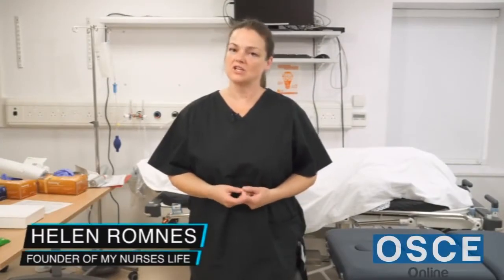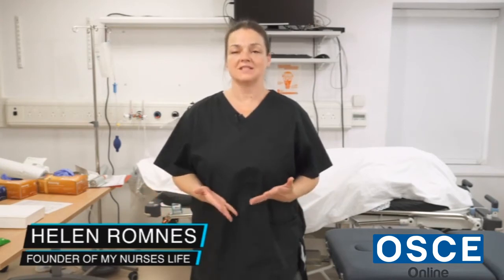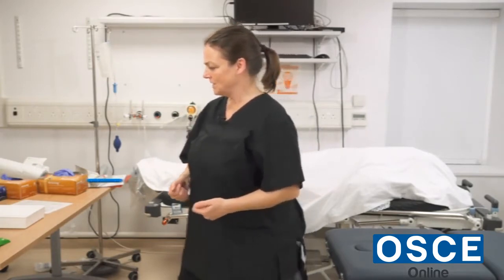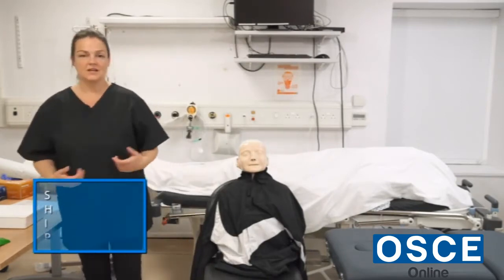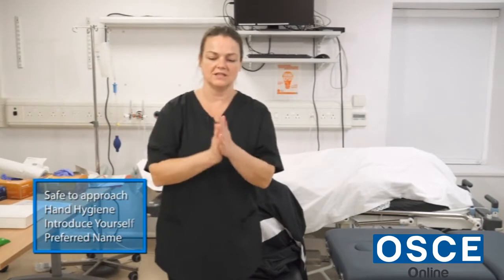I'm going to go through the inhaled medication administration scenario. It's basically always the same medication, it's salbutamol, and we're using a spacer device, which is a more effective way to take the inhaler rather than the inhaled medication just hitting the back of the throat. So I'll go through that scenario with you now. Okay, so same thing, I would declare the area safe to approach, do the 7 steps of hand hygiene.